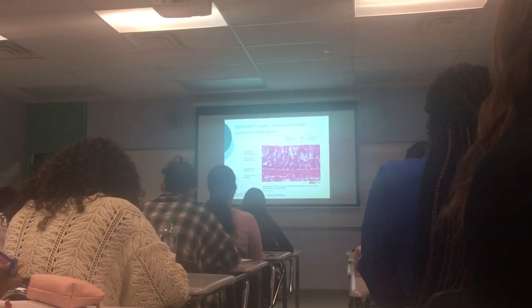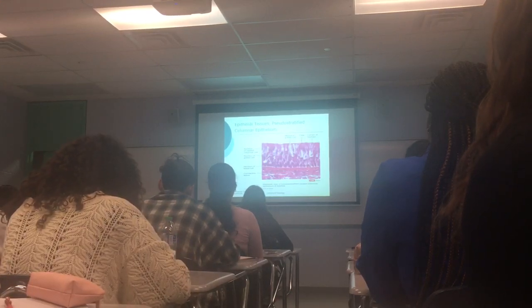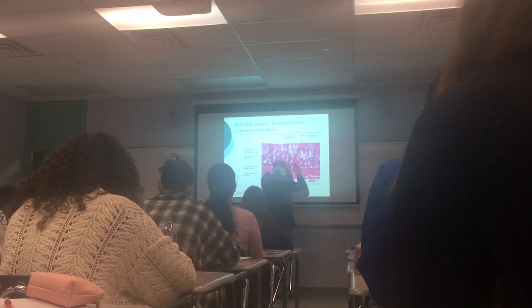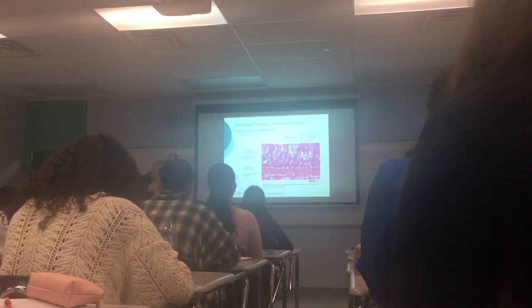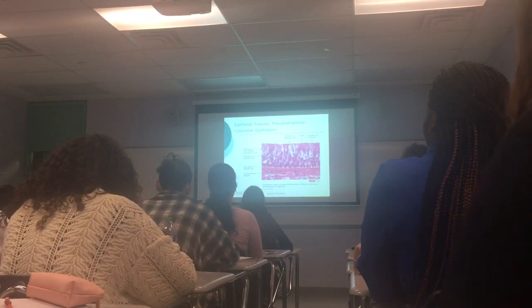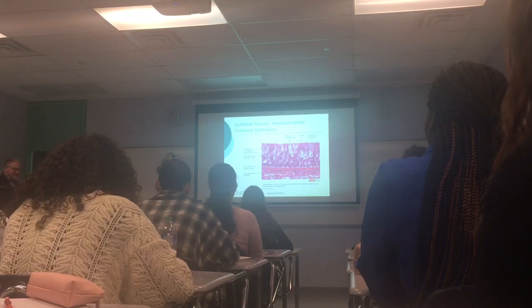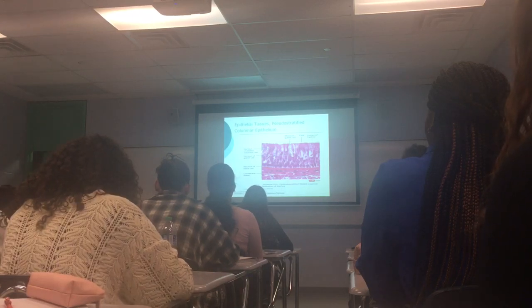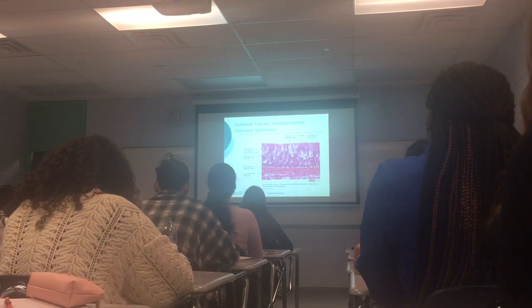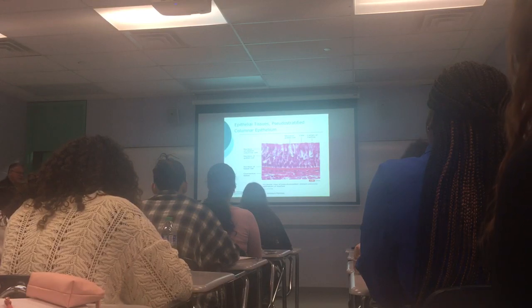Now all these cells, when you look at them, you know they're elongated cells, but at first glance, it looks like there's multiple layers. There's really not. They're kind of just all squished in together there, okay? So they call that pseudostratified, okay? So it's ciliated, there's a cilia, so it's called pseudostratified ciliated columnar epithelium, okay? The big white cells here, big fat happy white cells, these are goblet cells. Okay, so goblet cells secrete mucus.